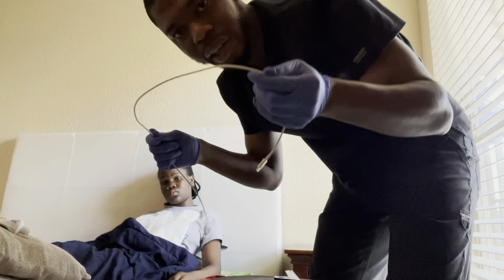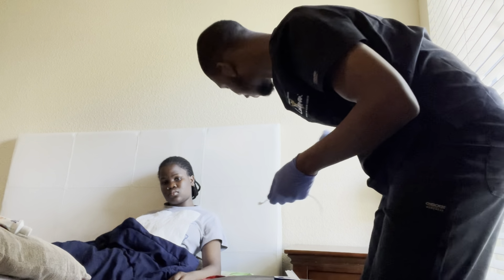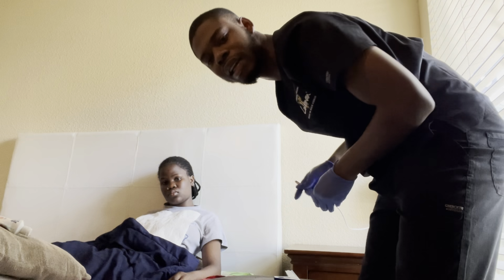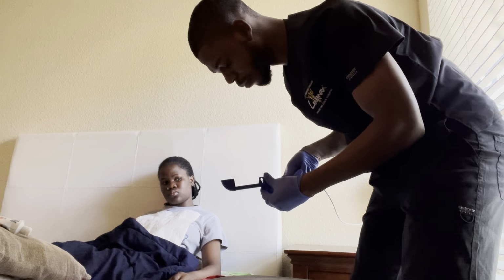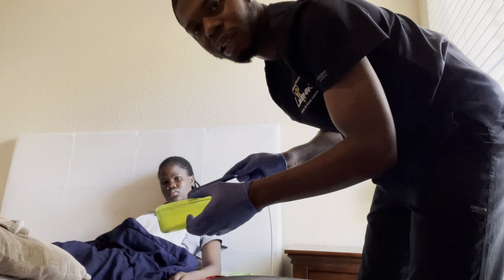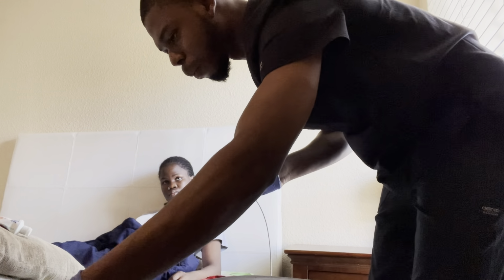I will take my suctioning tubing and I will connect it to the suctioning machine. I will turn on the suctioning machine. I will take the other end of the suctioning tubing and I will connect it to the Yankauer catheter. Now that I'm done, I will suction a little amount of water to verify that the suctioning mechanism is working perfectly.